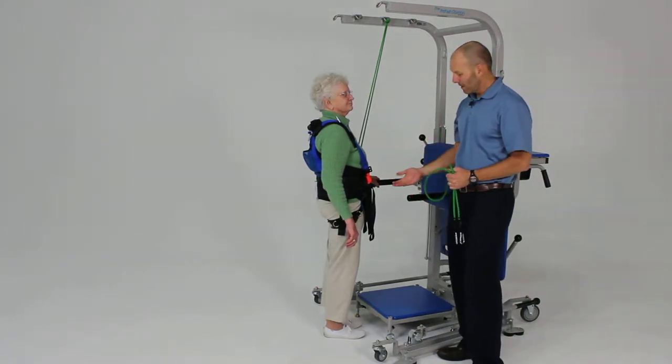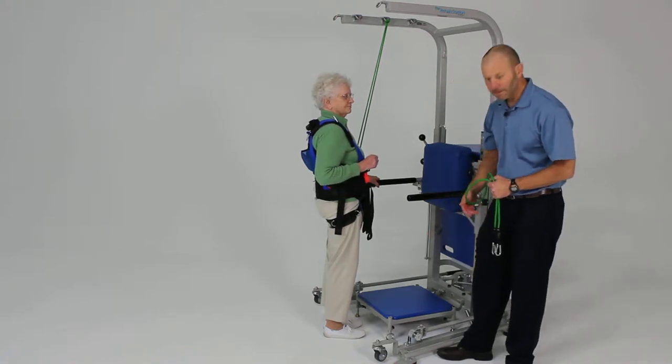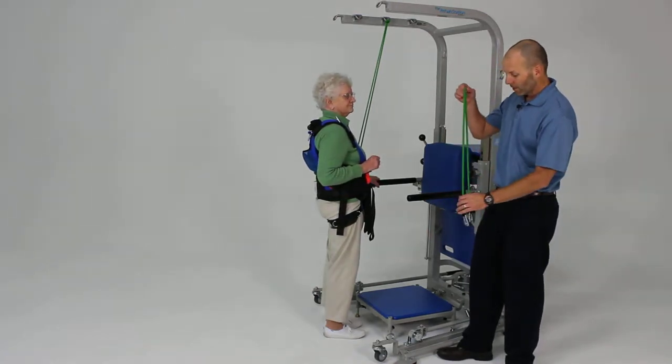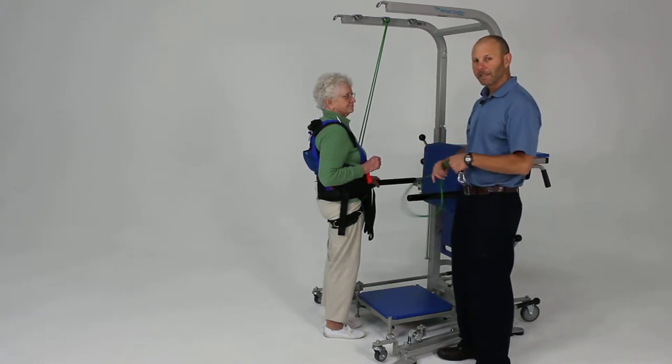Another functional activity we can do is step-ups, practicing with the adjustable step. In this case we have it set on a six-inch level and we're going to do some assisted step-ups. The person is requiring a little bit of assistance to get up that step.